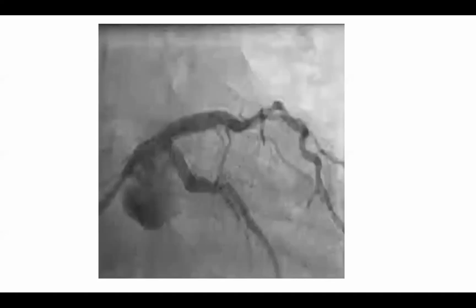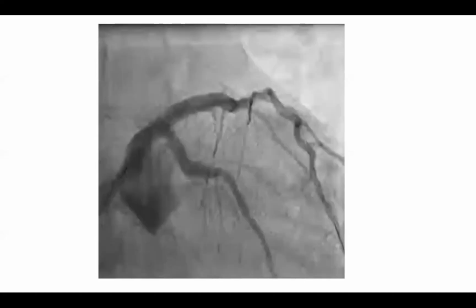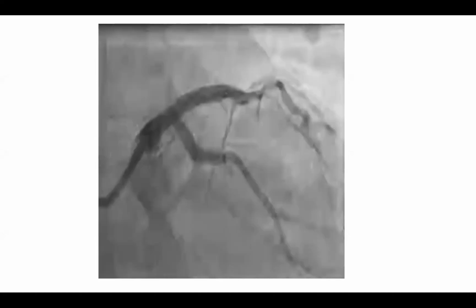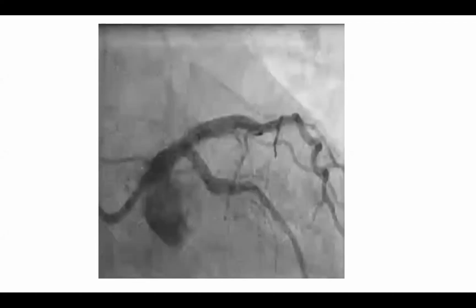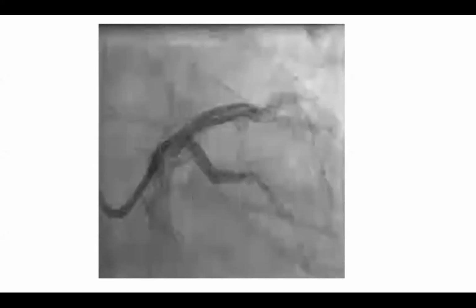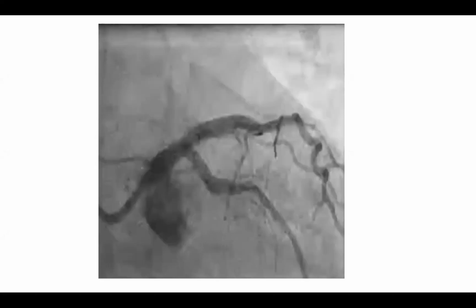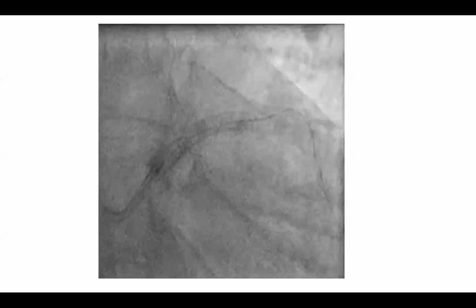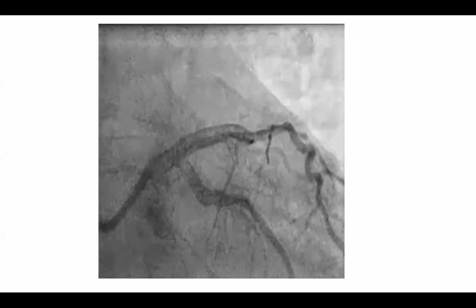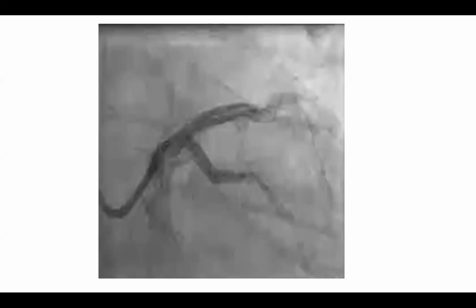What is the advantage of doing sequential balloon dilatation before the kiss, or would you just go straight off with the kiss? No, we did the sequential balloon dilatation. We did it with the 4 and 4.5, and then did the kiss, and then the final parts with the 5 balloon. I think the LAD was very well prepared. They had used cutting balloon, and I think it's got a beautiful result, I must say.